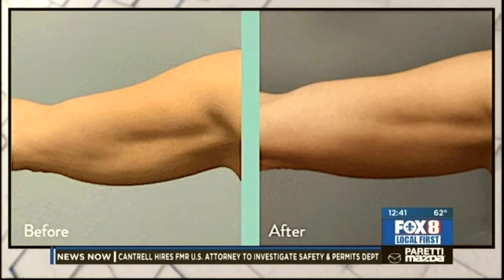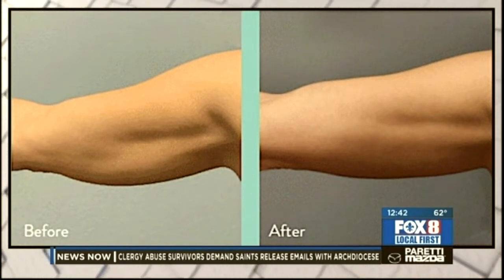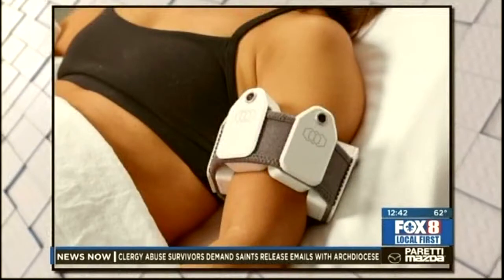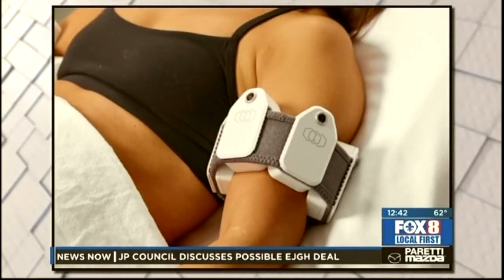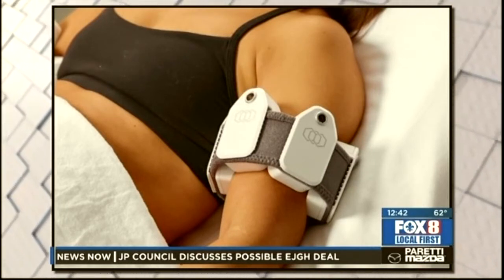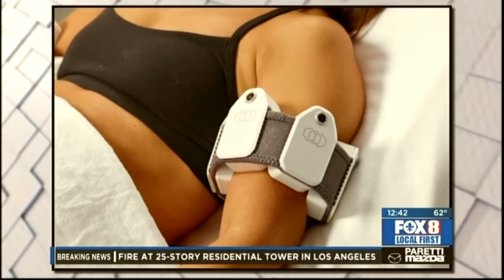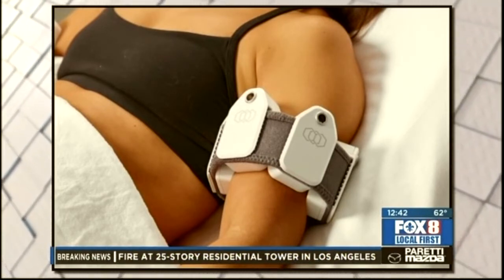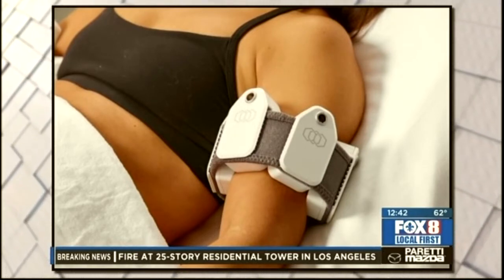It comes into display on this one, and you do multiple treatments. And there's something wrapped on the arm? It's wrapped, and what it does at that time, it raises the temperature to 40 degrees to permanently kill the fat cell, and at the same time the raised temperature tightens the tissue, so you don't have to cut the skin away. Traditionally you remove the fat and then you have to remove some skin with it because the skin is going to be too loose. But with this device, you don't have to do that.